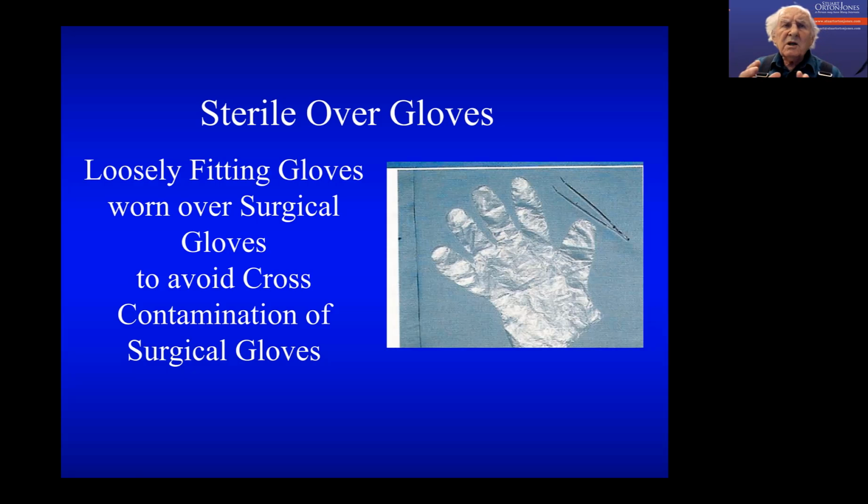All you'd be doing is positioning the X-ray head. Okay, then that should be okay. And with gloves, we would pack 3 in a pack. The normal examination gloves, we put 3 in a pack, which means that you put 2 of them on, and you've got a spare one which you put on the aseptic surface. And then if you need to re-glove, there's a sterile one ready for you.